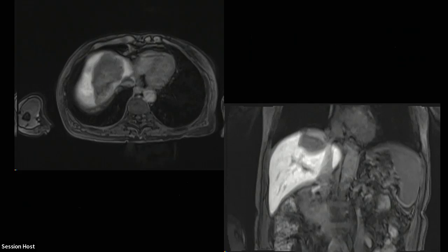This person did not get a hepatic vein thrombus, but I mentioned to a couple of people coming through, this is a technical issue when I burn around large vessels, particularly the hepatic veins. I do put people on prophylactic Lovenox after, because I have had a few people over the years who had hepatic vein thrombus. It might be overkill to put them on prophylaxis after you just burn a giant hole in your liver, but that's what I do. So you can see, we can be pretty aggressive.